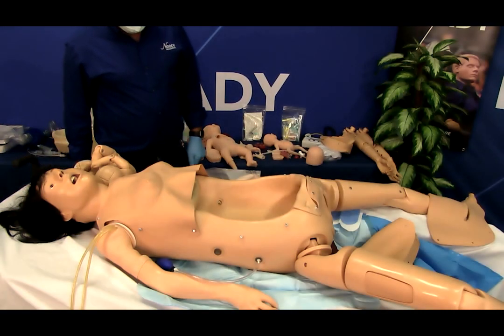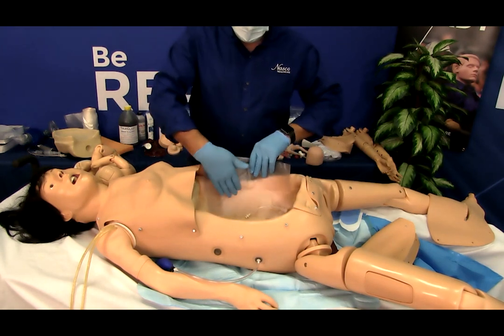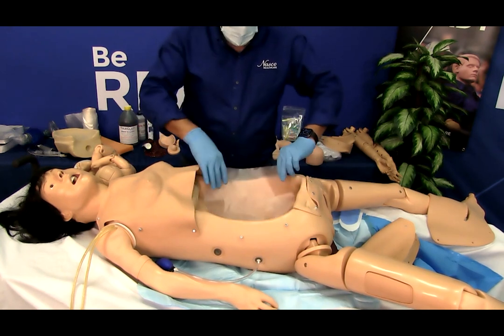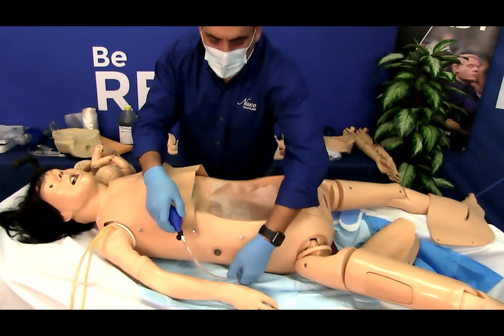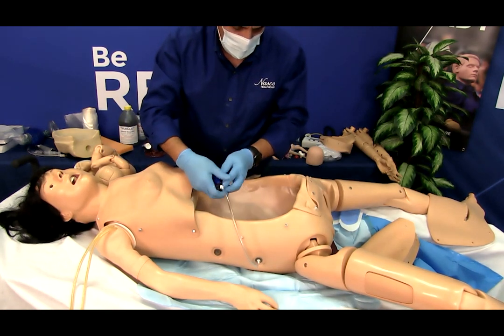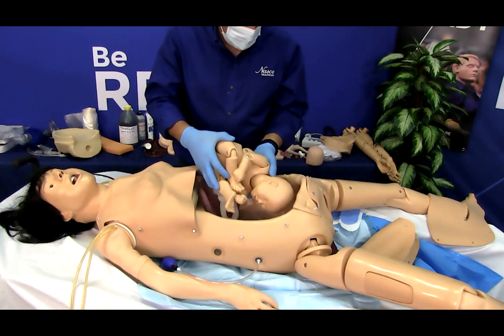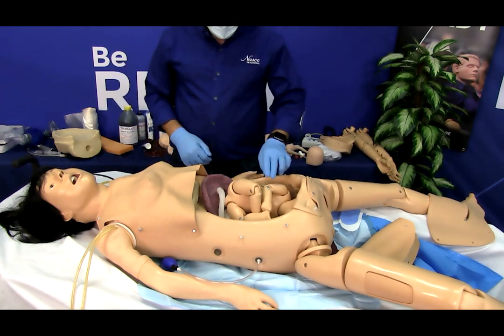To simulate shoulder dystocia, lay the positioning bag crosswise in the lower torso and connect the tubing to the lower side port. Attach the inflation tubing with squeeze ball to the lower port on the outside of the torso. Position the fetus. Inflate the bag slightly, raising the fetus to the desired position.